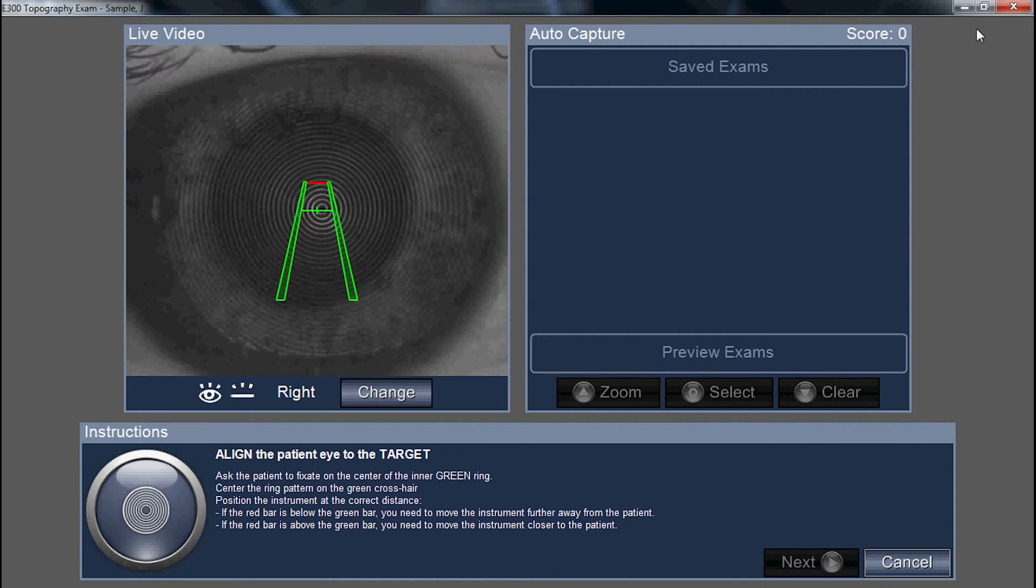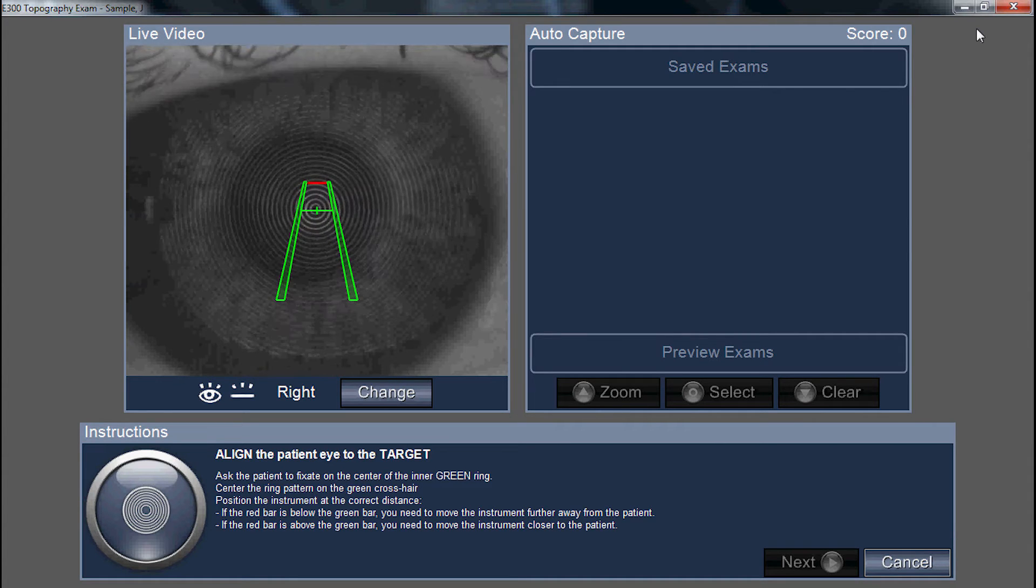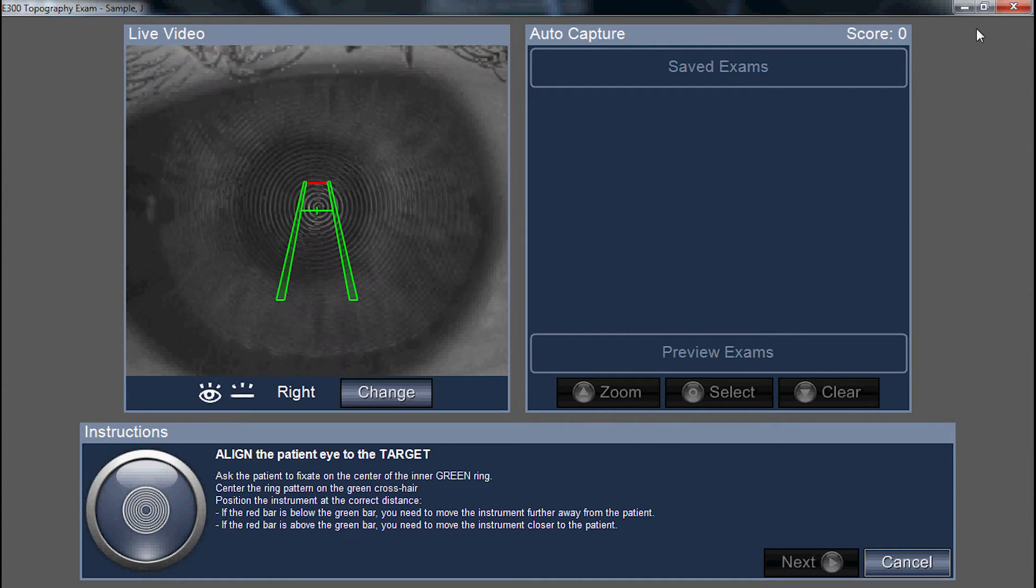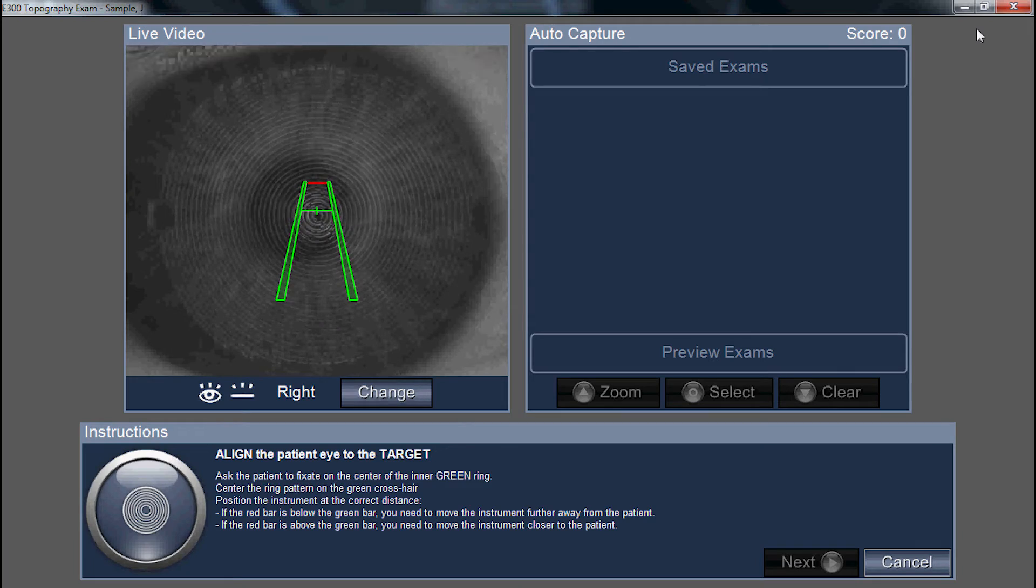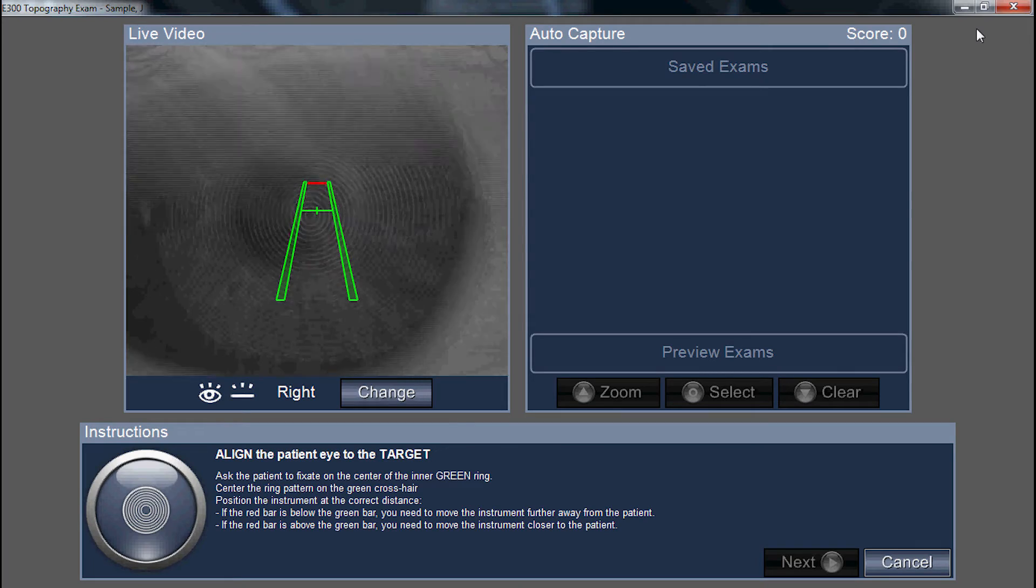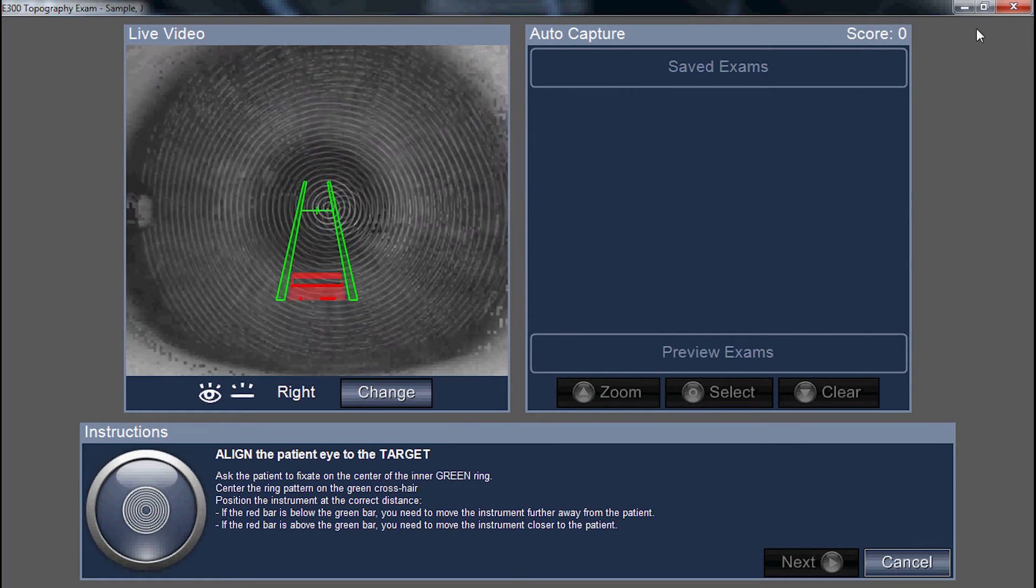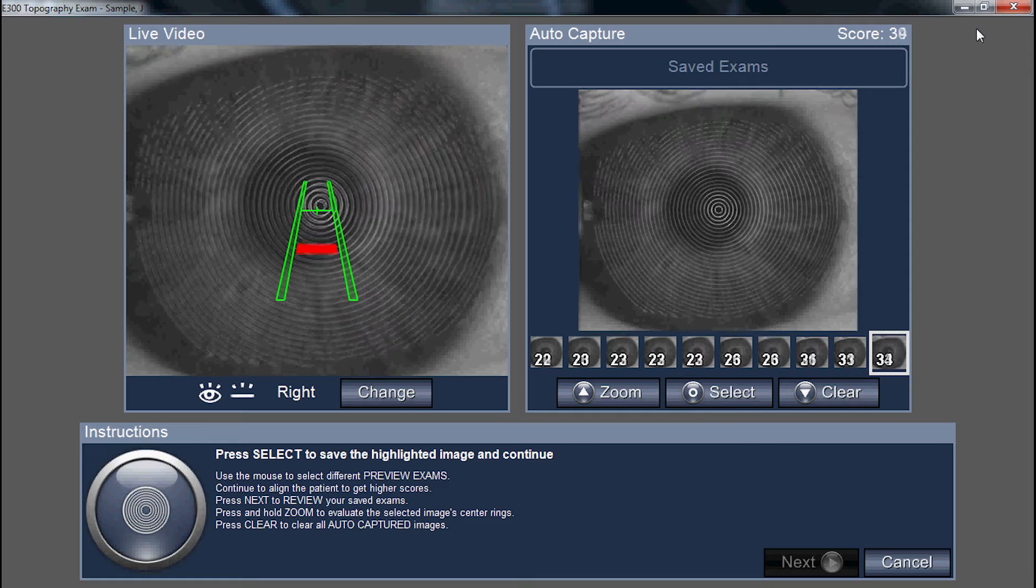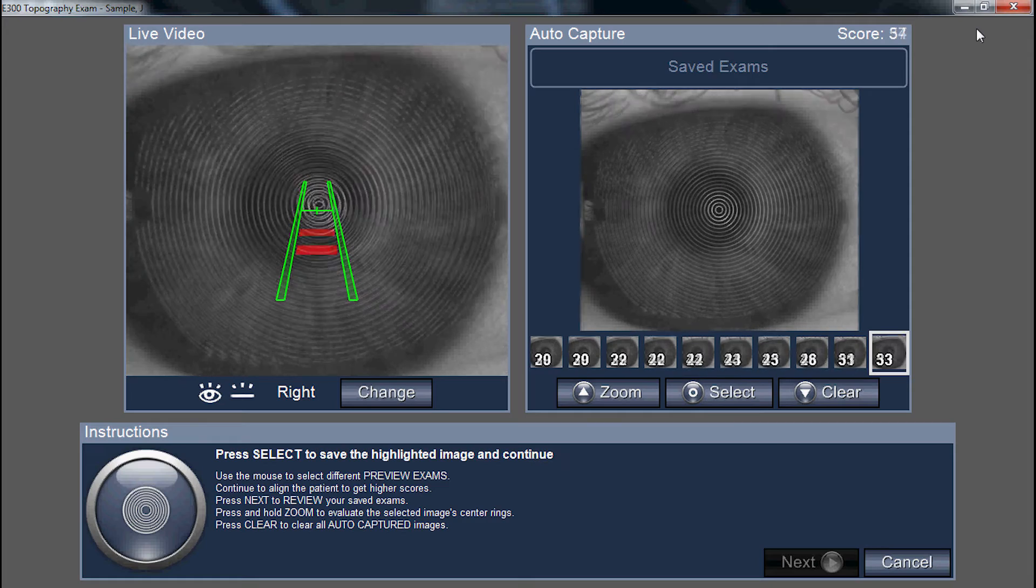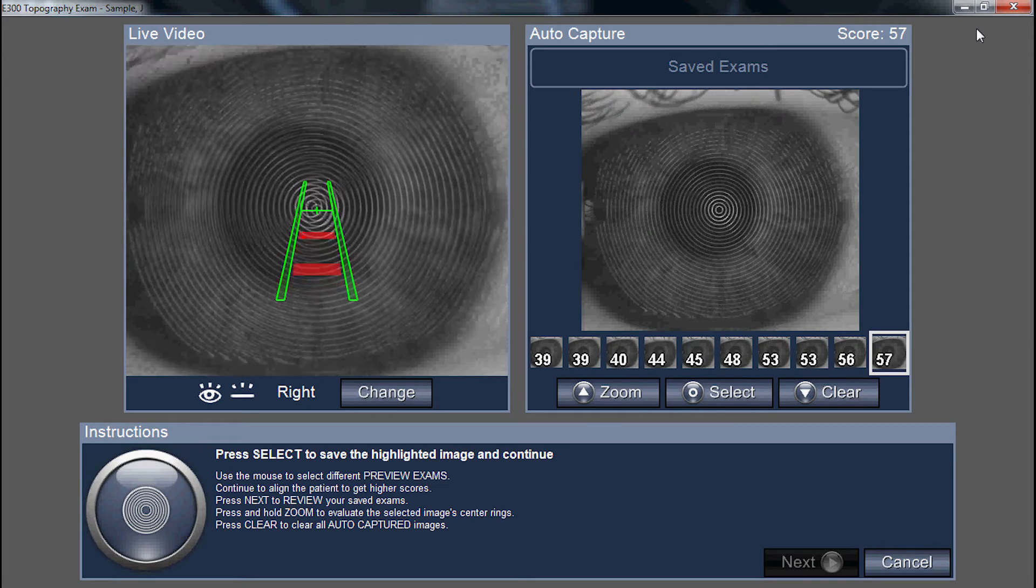The red line indicates how close or far away we are from the eye. While the red line is at the top of the runway, we're too far away from the eye. While the red line is at the bottom of the runway, we're too close. We'll line up both the green and the red over the apex ring.